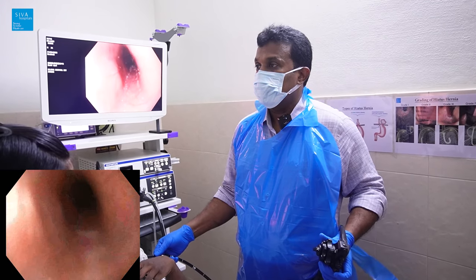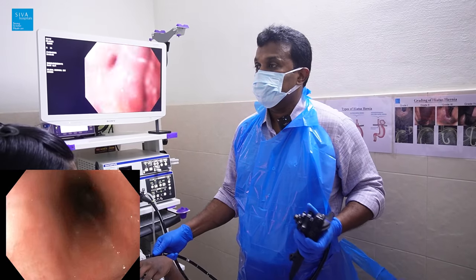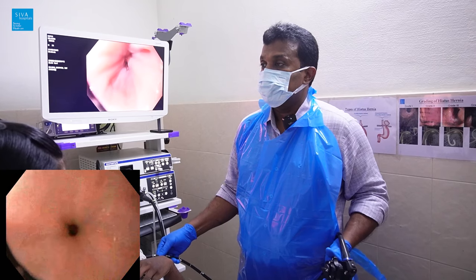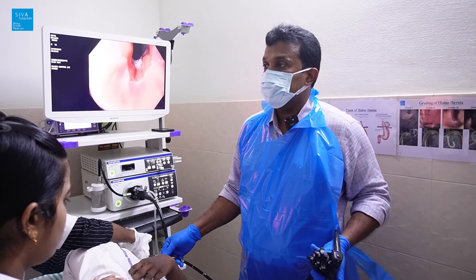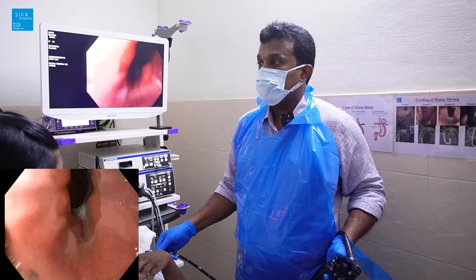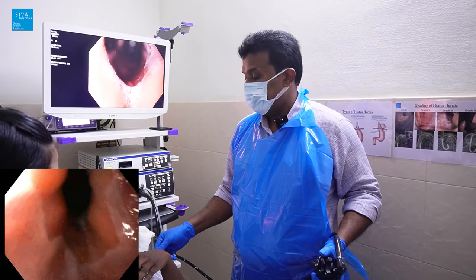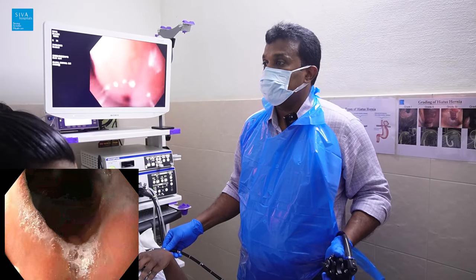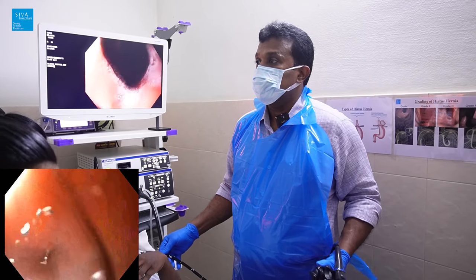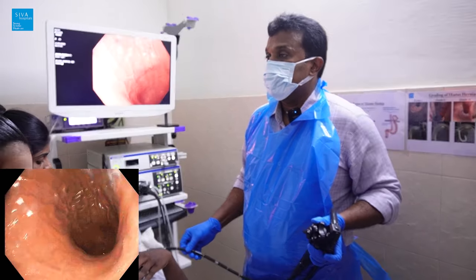This is the middle esophagus where you can see the cardiac pulsation. Now this is the lower esophagus, where the esophagus and stomach join — the esophagogastric junction at around 38 centimeters. It looks a little lax. Going inside through the lax OGJ junction into the stomach.